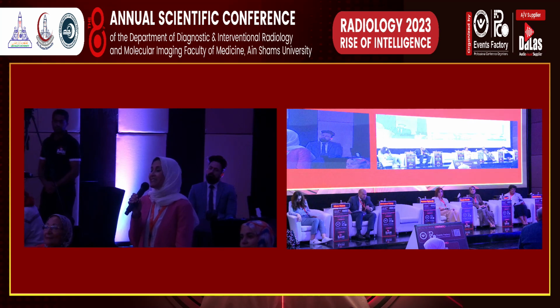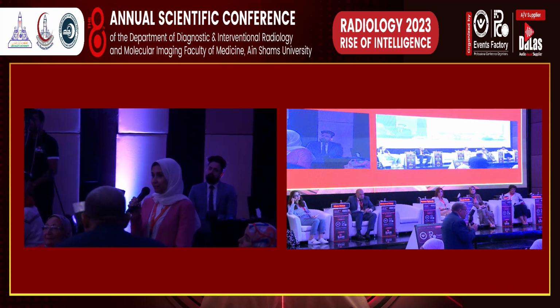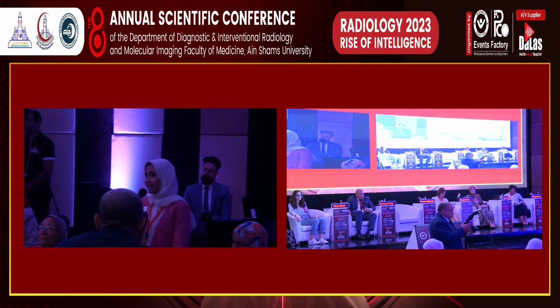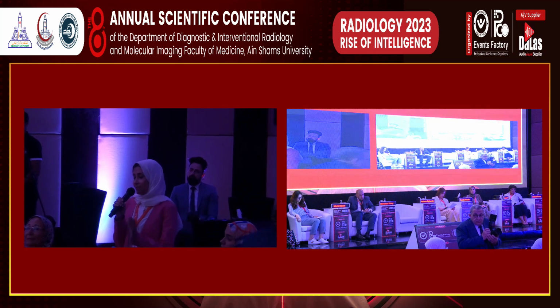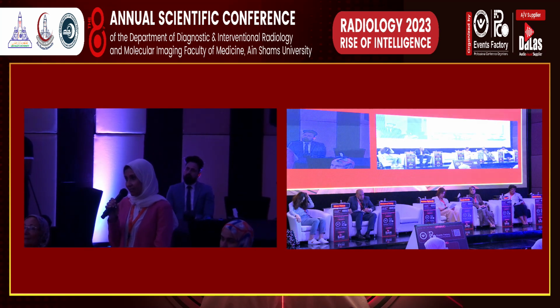صباح الخير، ازي حضرتك؟ طبعا هو اول حاجه زي ما حضرتك قلت، احنا اول حاجه بنأكد عليها دايما مع العيان هو الجود بريباريشن علشان نقلل الفالس بوزيتيف ويطلع الفحص مظبوط باقصى حاجه نقدر عليها.